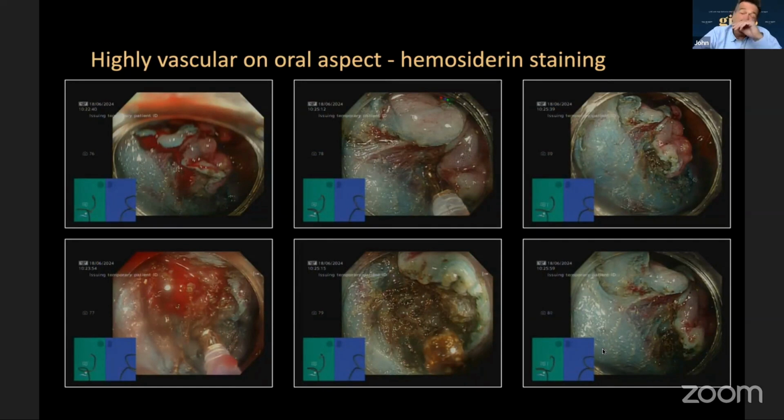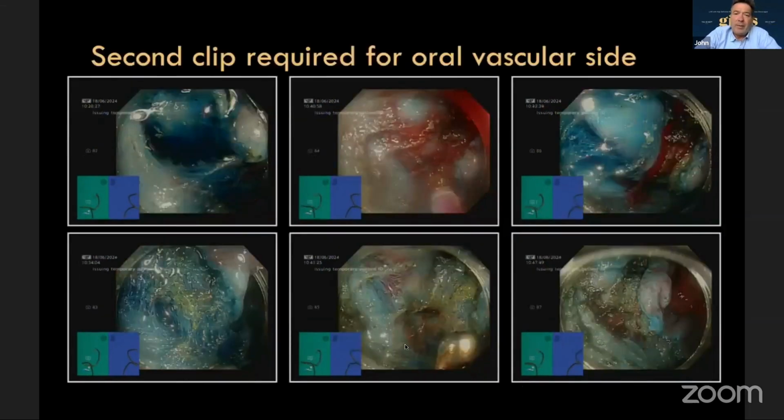the tissue. And when you have an area like this, you worry about the fact that, could this be an area of change because it's obviously drawing a vascular supply, or is it a big nodule? We eventually managed to control the bleeding, and then we put a second tether on.